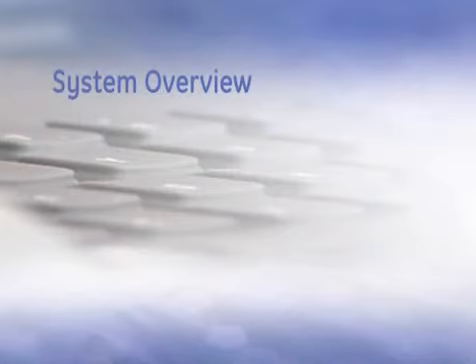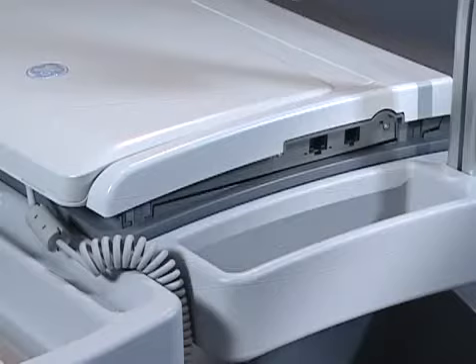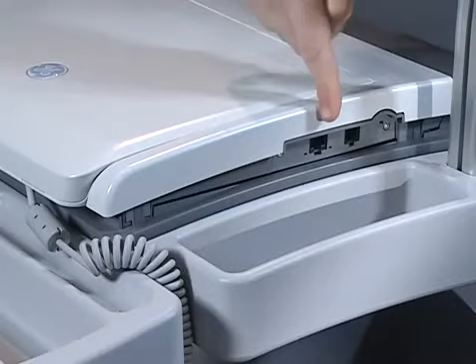Let's begin by reviewing the keyboard and other components you'll need to know for your quick start. We'll first look at the unit with the display screen closed. If you're using your MAC 5500 to follow along, we'll consider the area that holds the display as the front of the unit. Looking at the right side of the MAC 5500, we see two connection ports.